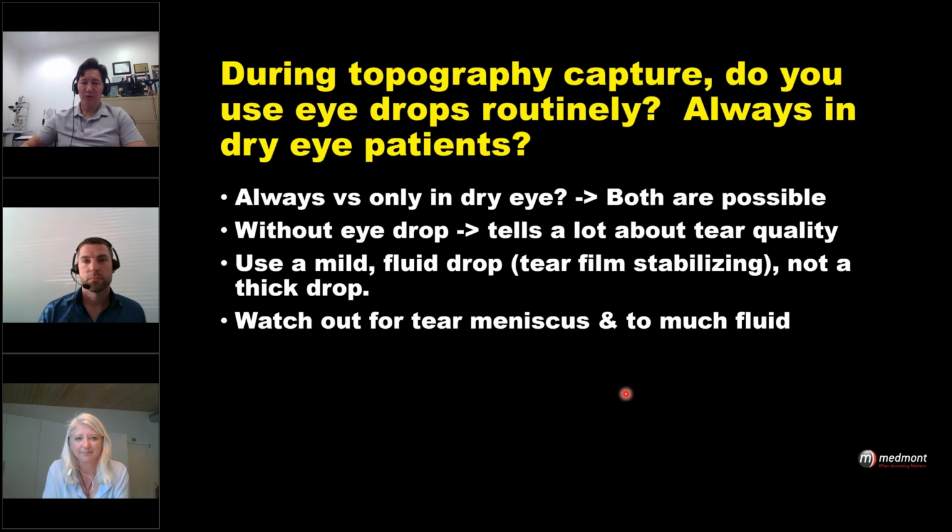I'm curious what your thoughts are related to scarring. If you've got a patient with a central cone that is fairly scarred and the ring reflection is similar to a dry eye patient where it won't smooth out, I'm curious how you might address that, especially when it's those central rings. Nikki, your thoughts about scarring?